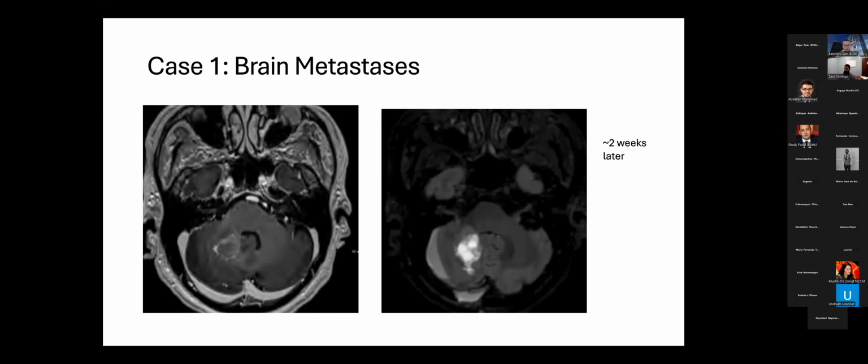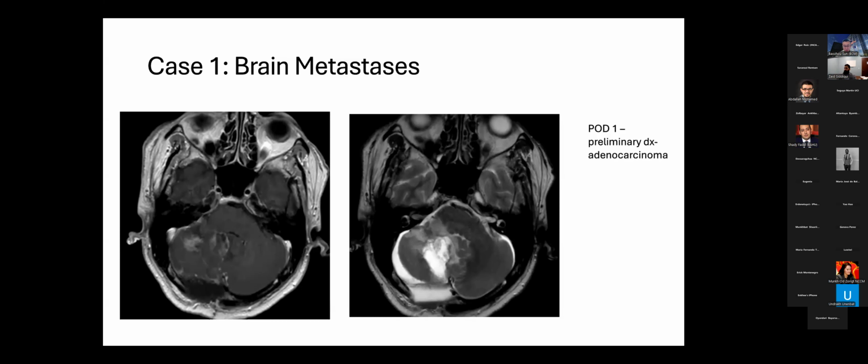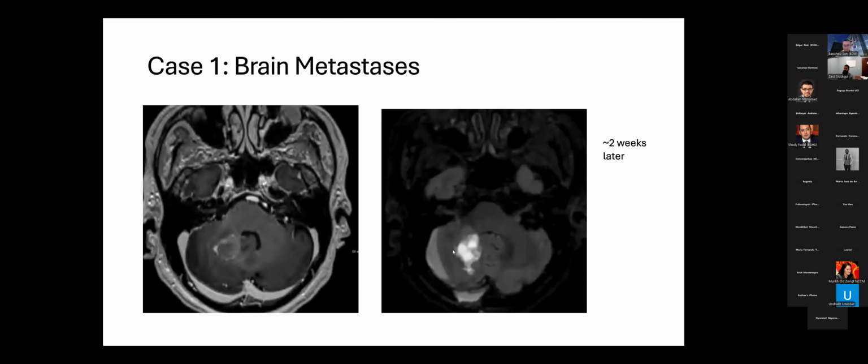So what you can immediately notice compared to the pre-op is that on both T1 and T2 scans, you can see that the cavity is smaller compared to the immediate post-op scan. And that allows us to deliver radiosurgery with less toxicity because the target will be smaller.